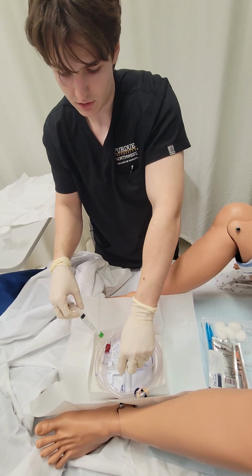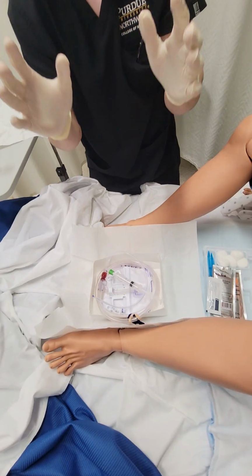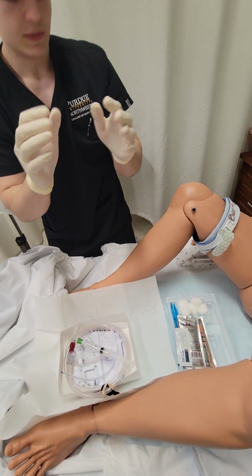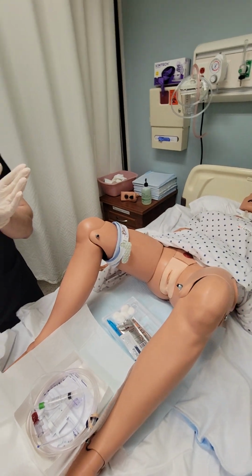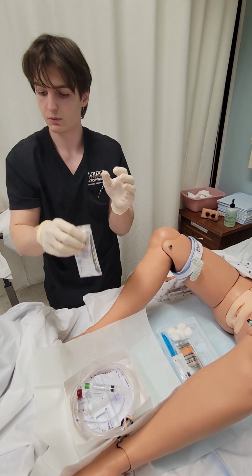I'm going to have that inserted for now. Set that there. Okay, do you have any allergies? Oh, you have an allergy to iodine. Good to know. So then this is our iodine here. We'll not be using that.